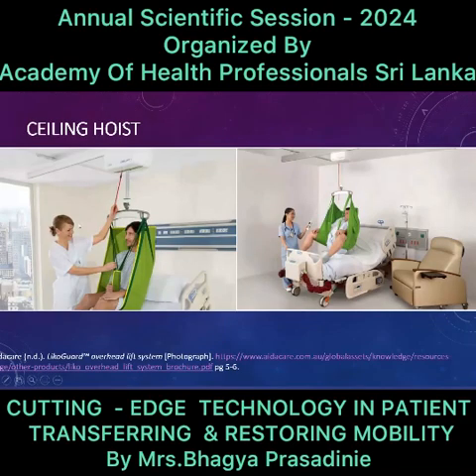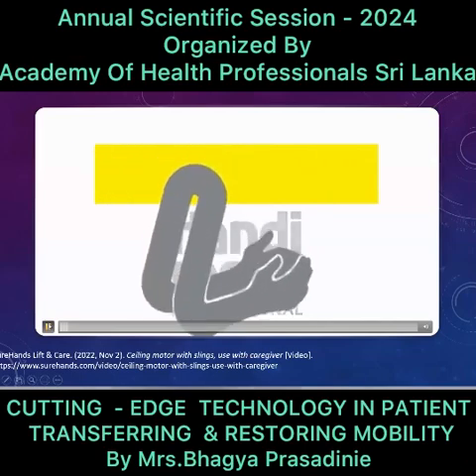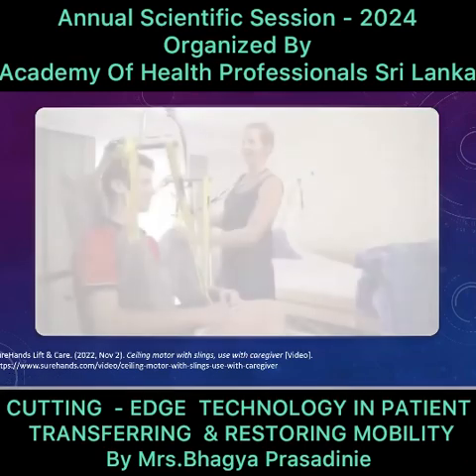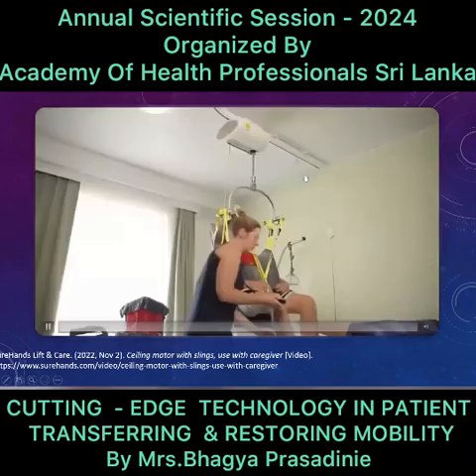This is how we transfer a patient with the ceiling hoist. So you can see we attach the sling under the patient, and we attach the sling to the hoist up on the track. So with the remote controller, we can control the transition, like taking the patient up from the bed and putting the patient down and everything. So I'll quickly move on to a quick video regarding that. I hope you can hear. So this is the track I have talked about.